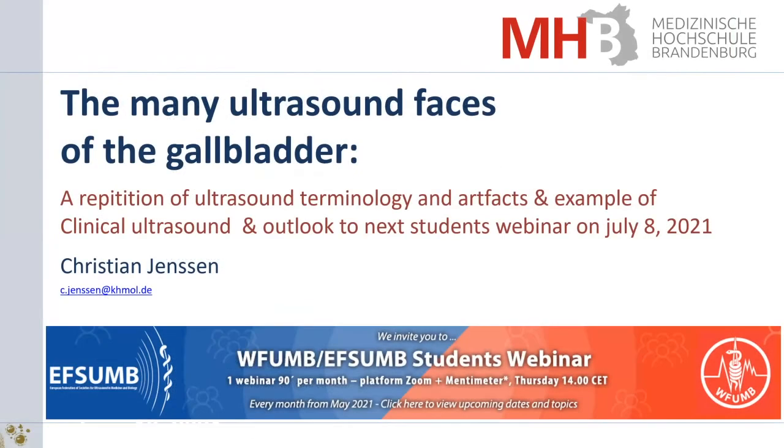This will be a repetition of something you have already heard: ultrasound terminology, what is echogenic, what is hyperechoic, what is echo-free or anechoic. I will give you also a few examples of artifacts and will show you examples which can be only interpreted on the basis of clinical information, that repeats clinical ultrasound.